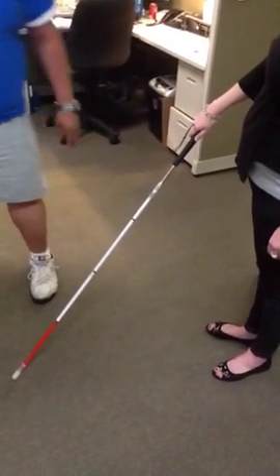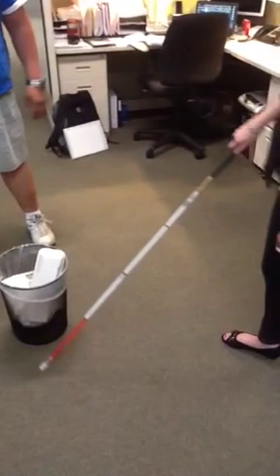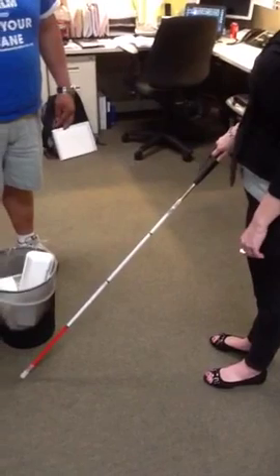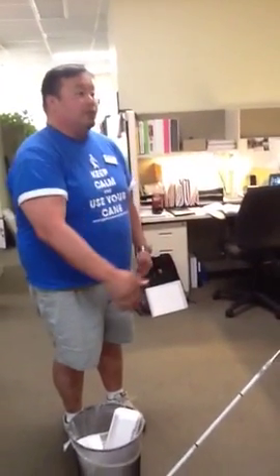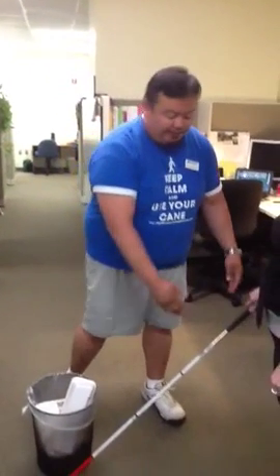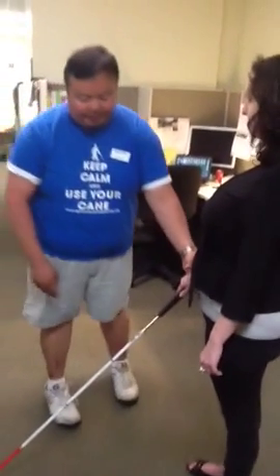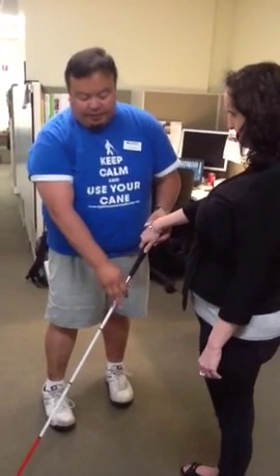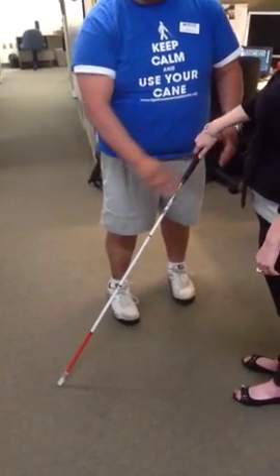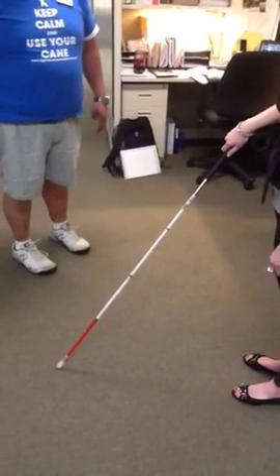What that does is, if you move forward, go ahead, take a step forward, it'll tell you things that are in front of you. Okay? So it'll always let you know if there's something like a chair or an end table or desk. Remember that because it's diagonal, it covers the width of your body, just like so. So you've got to keep it in front with the tip to the side, with your finger kind of facing towards you and downward. So that's going to be the diagonal technique.